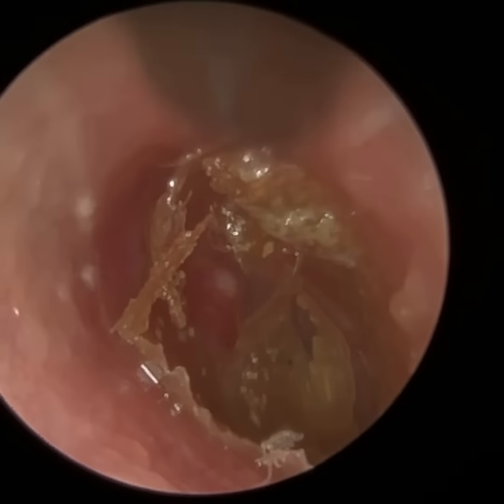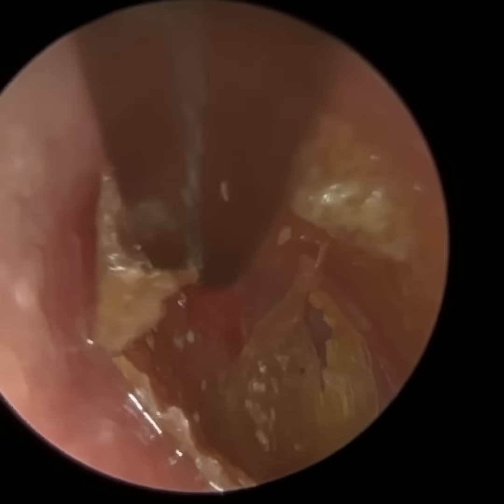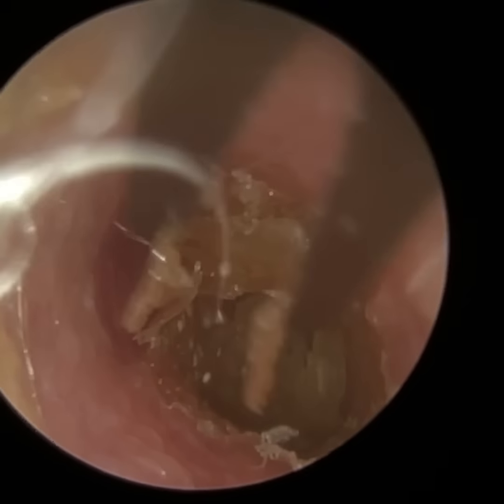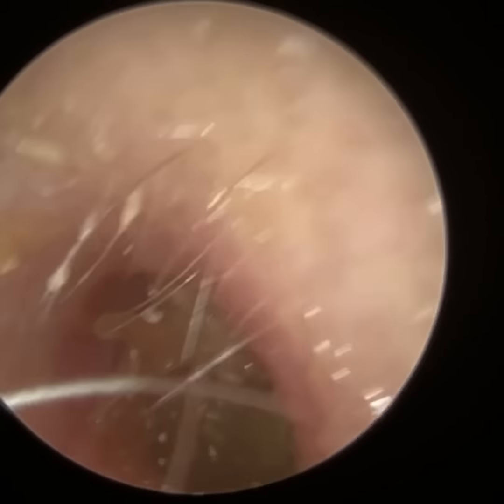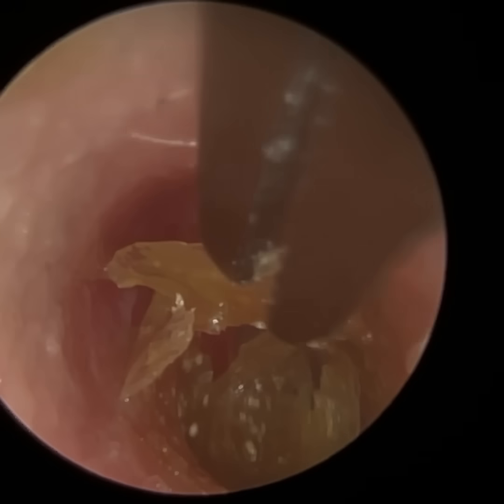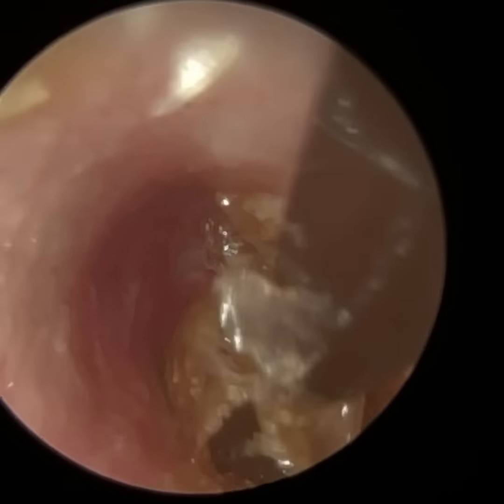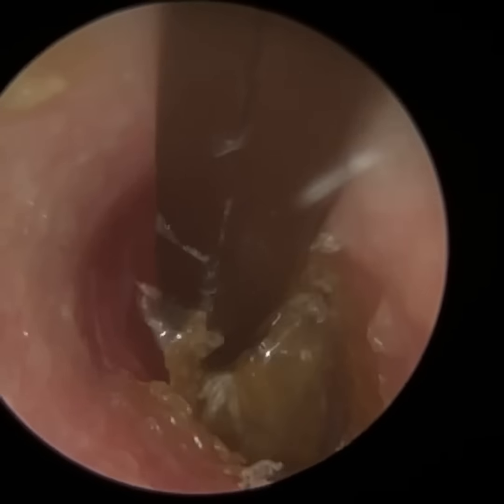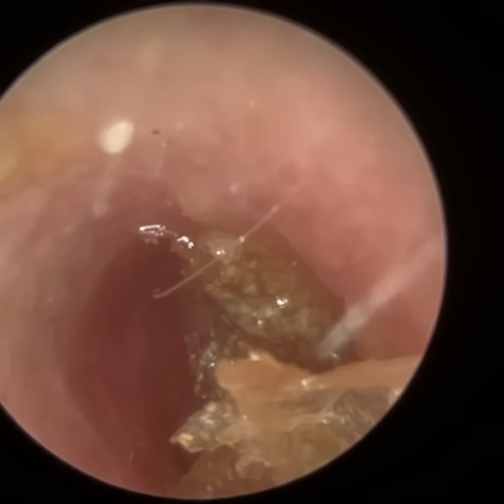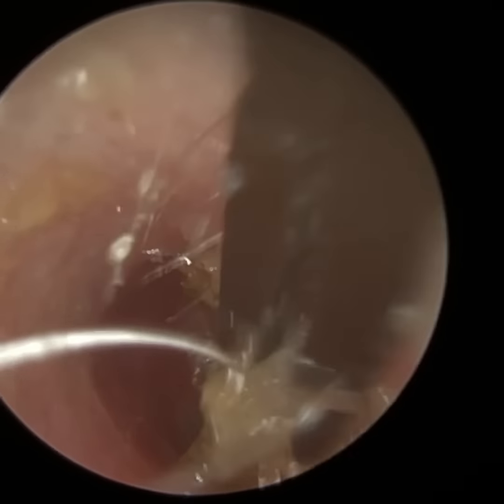I've created enough of an opening in this region where I can get the forceps — I managed to get the top jaw in between the canal and the skin, so I peeled it away a bit further. And in a moment this is all going to come away in one piece. Yes, you can see that came away in a big slither. Some of it just got left behind in the canal, so I'm just going back to remove the next piece.